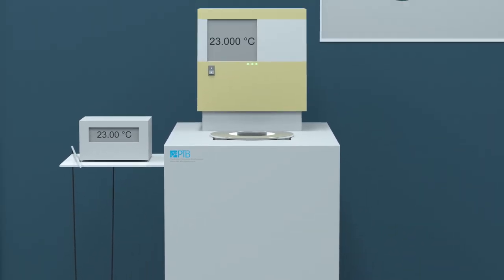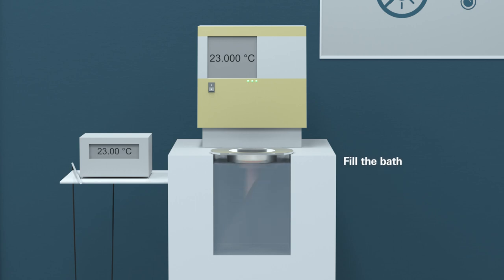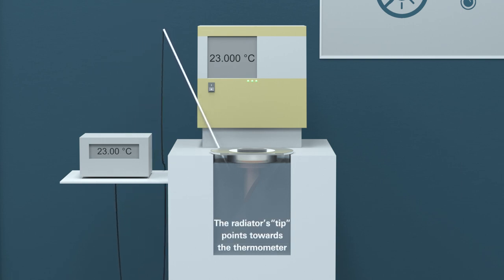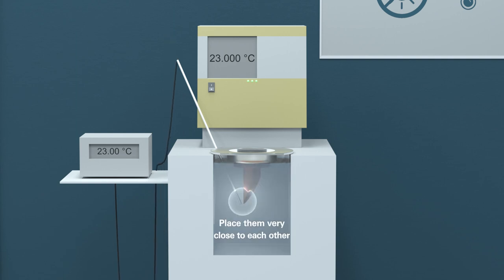To prepare the measurement, first fill the bath. Insert the reference thermometer and the cavity radiator into the bath such that the radiator's tip points towards the thermometer. Place them as close to each other as possible. Make sure that all metal parts of the cavity radiator are immersed in water.